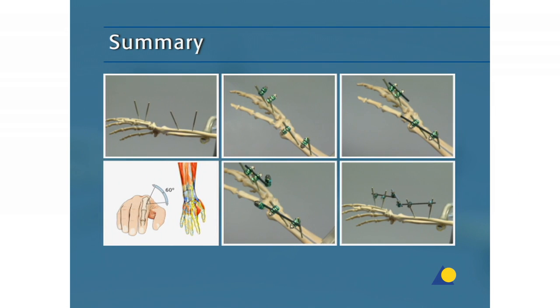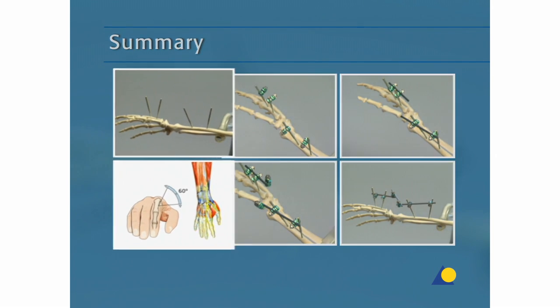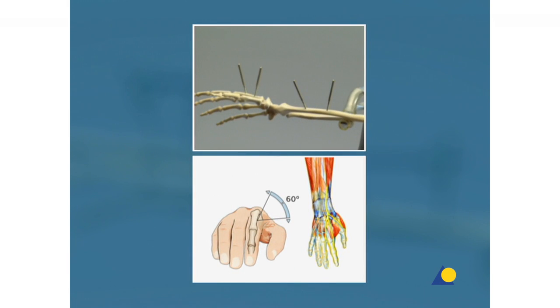This presentation has demonstrated the positioning of the self-drilling Schanz screws and the correct construction of the wrist-spanning frame.